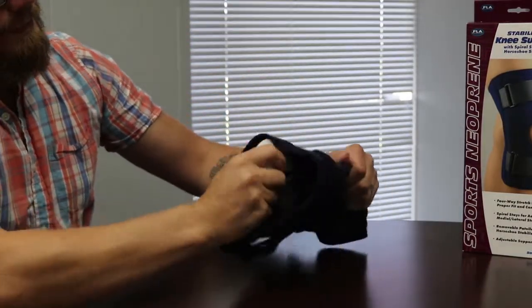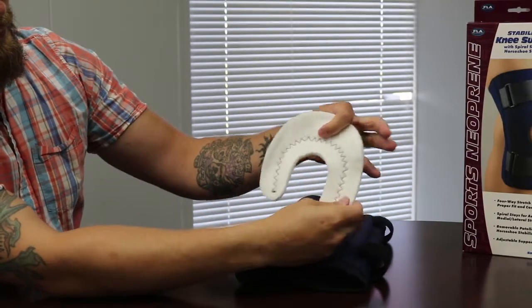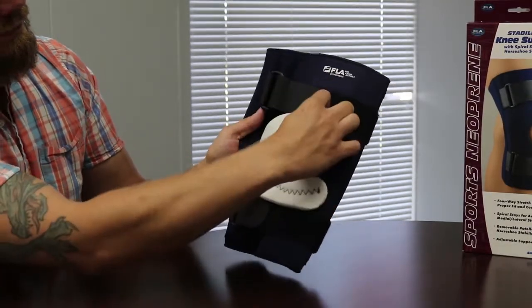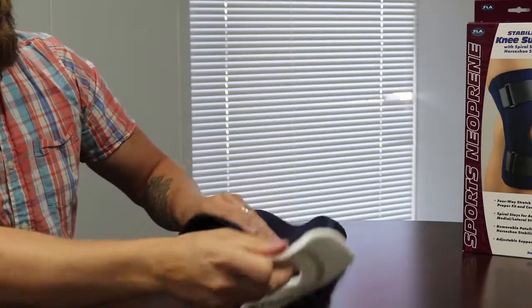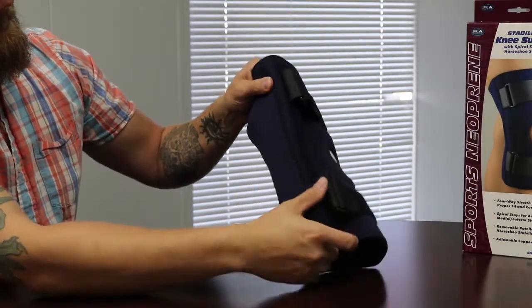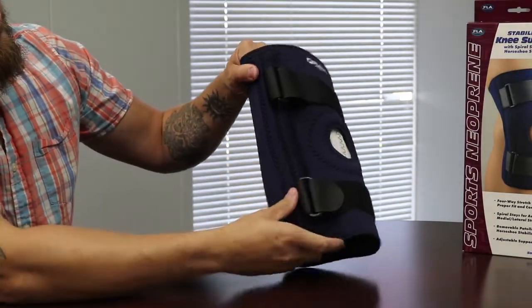The purpose of the horseshoe is to provide increased pressure around the patella for patella tracking issues. The spiral stays in the brace provide medial and lateral stability. To simplify: if your knee needs support side to side and feels unstable, or your kneecap needs support in any direction, this brace can help you out.